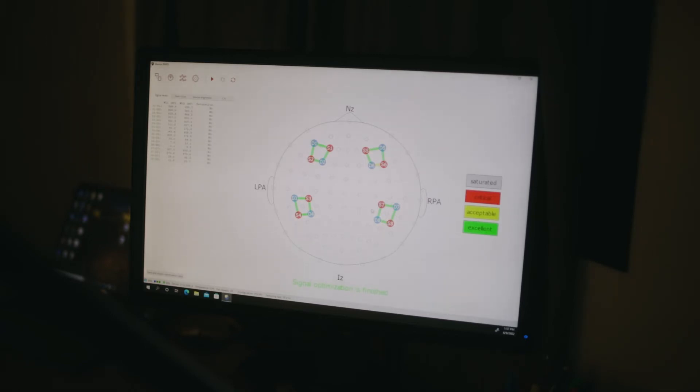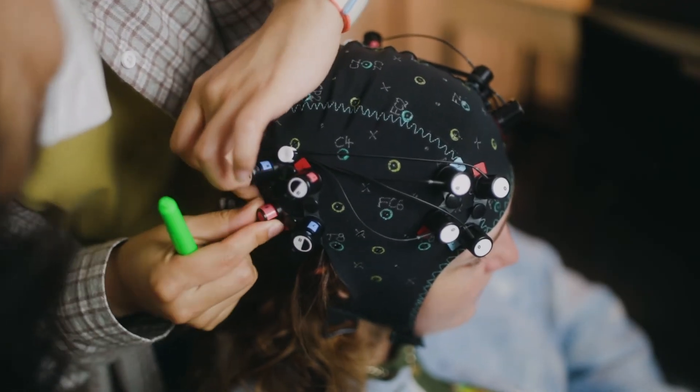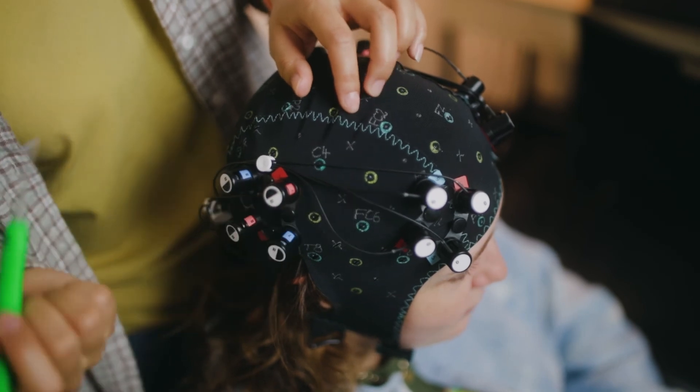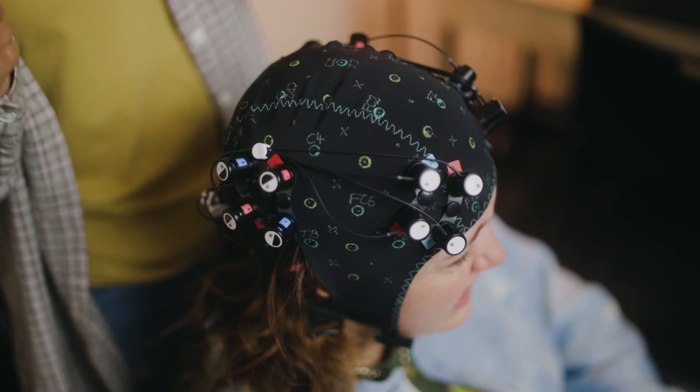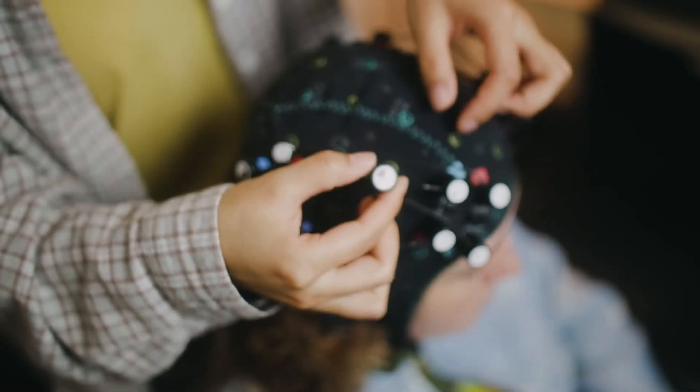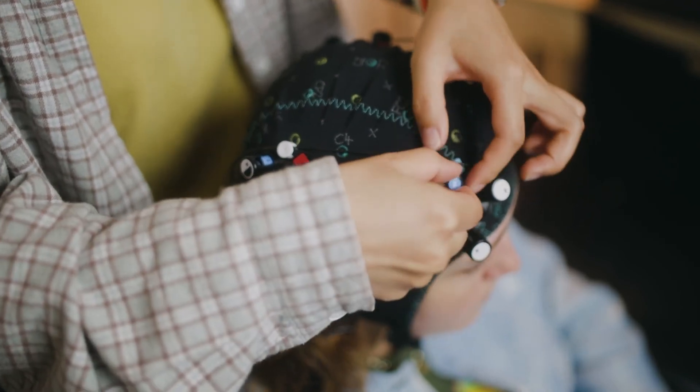It looks like Ying fixed all of them. We do have one acceptable on the frontal area on the right side. The spring toppers in the frontal area are all at tension zero. Because there's less hair there, she can use a higher tension spring topper — maybe spring one or spring two — which pushes a little harder on the scalp to make sure it's making contact. In regions with thicker hair, it might be helpful to use tension one, two, or three to really make sure the spring is holding down the optode and it's making contact with the scalp.